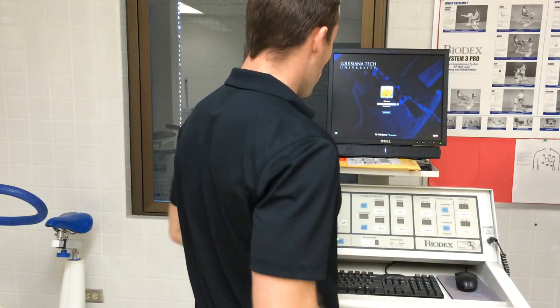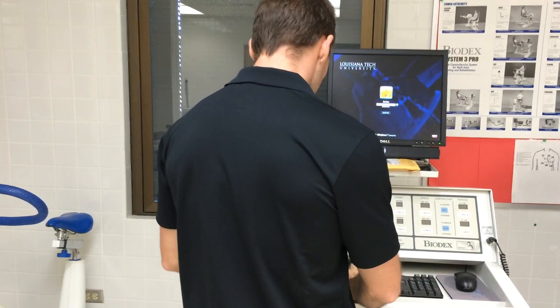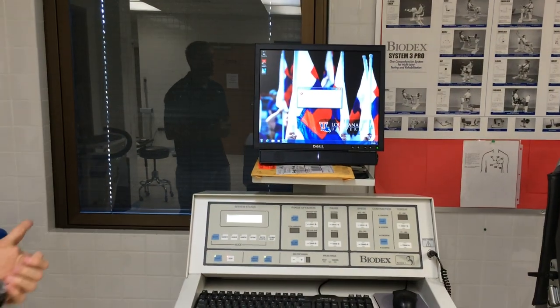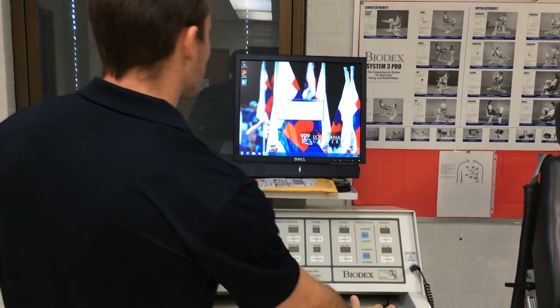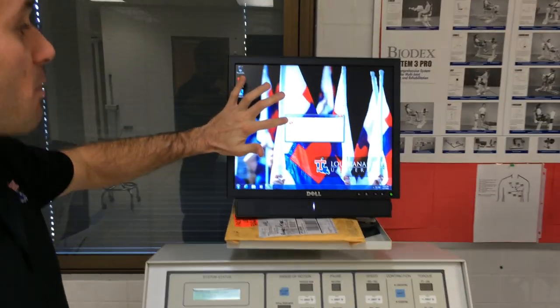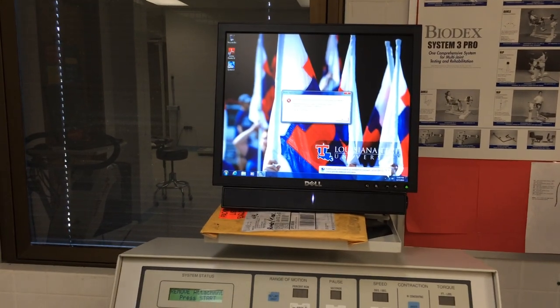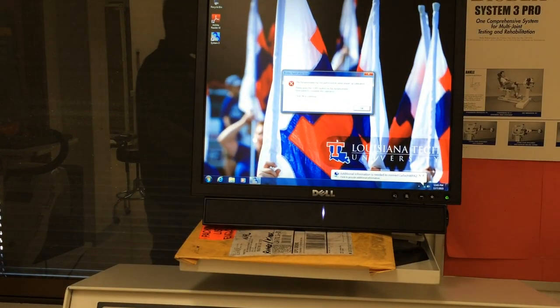And what we'll do is we'll move forward. We put in our password, APLMG224. This will get our computer ready to go. The first thing we're always going to see is this right here. It's going to say the dynamometer has not performed its initial power-up calibration. Please press the start button on the dynamometer. That's going to be this blinking start button right here.